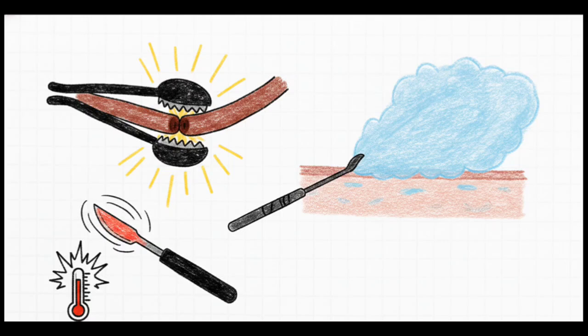And finally, ultrasonic devices. These use high-frequency vibration. They also have very little thermal spread. But hey, be warned, the active blade becomes physically hot. It actually requires a cool-down period before you let it touch anything else. Otherwise, you're risking a serious inadvertent burn.